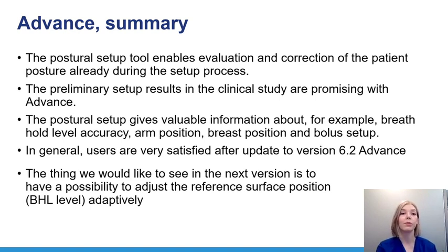Maybe one thing that we would like to see in the future version is to have a possibility to adjust the reference surface position or offset. This would give more possibilities to correct small systematic errors also in breath hold level and remain using the DICOM reference surface.